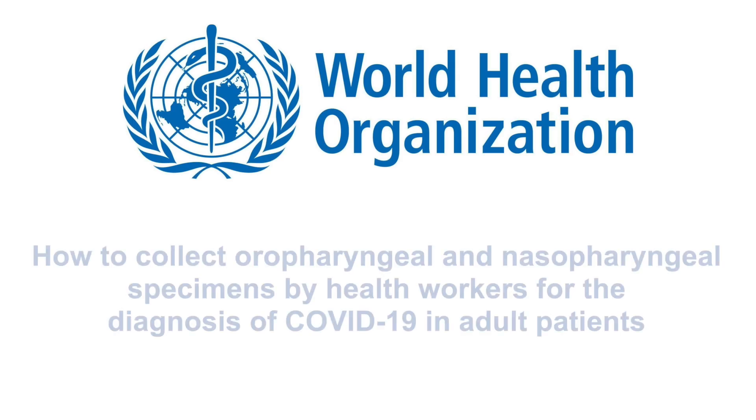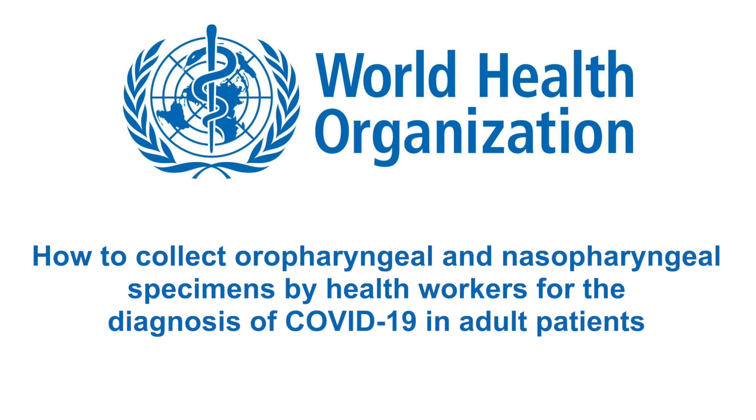In this video by the World Health Organization, we will demonstrate how to collect oropharyngeal and nasopharyngeal specimens by health workers for the diagnosis of COVID-19 in adult patients.